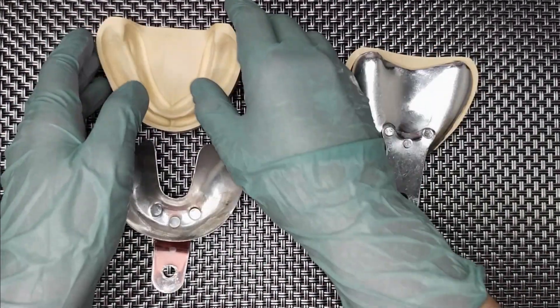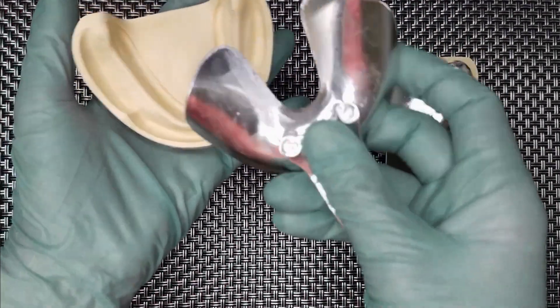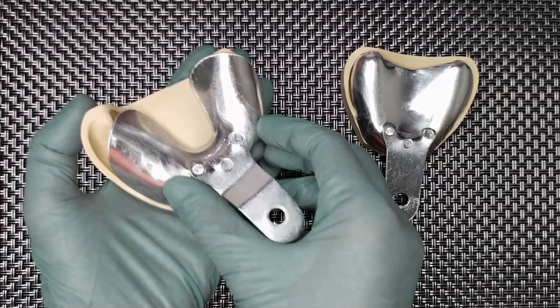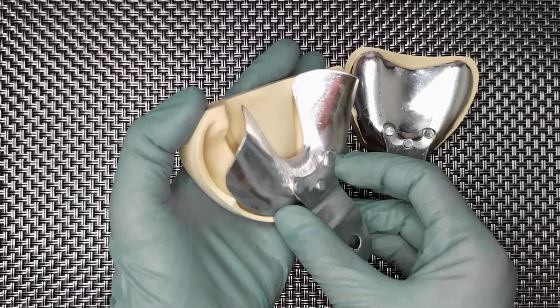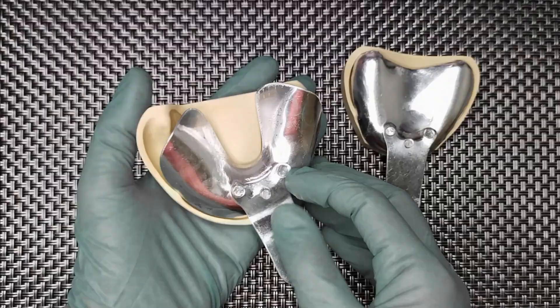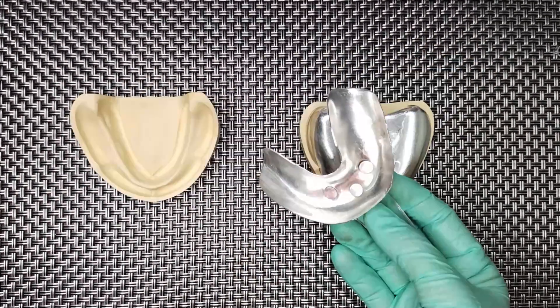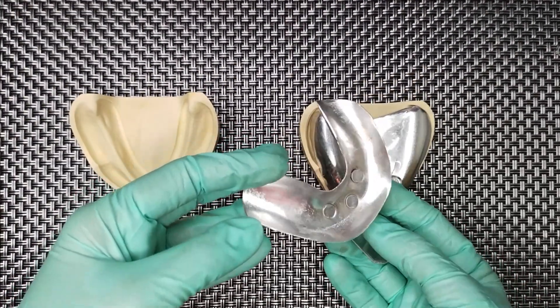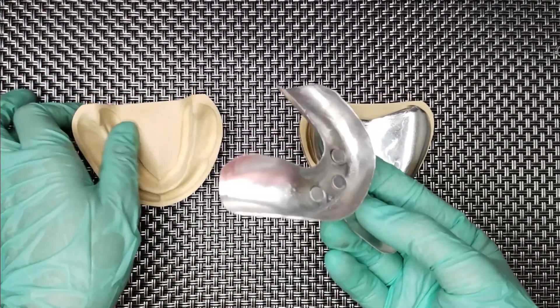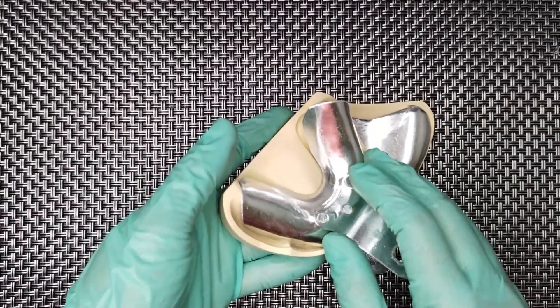Next is for your mandibular model. This should be shaped and cut also. Now this is the cut and shaped stock tray of your mandibular arch. Note the extension of this.